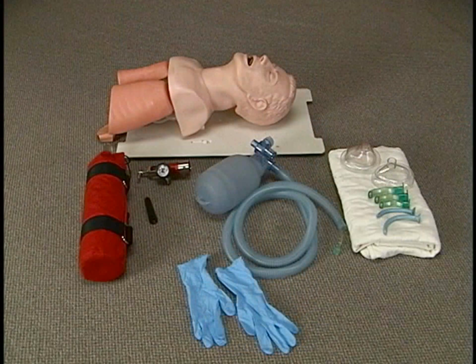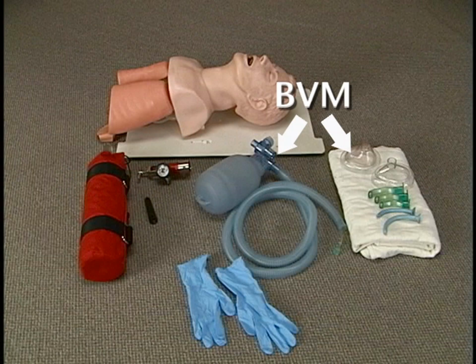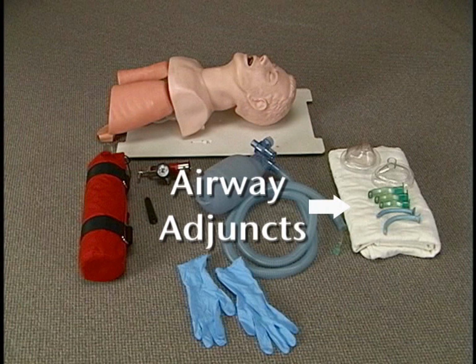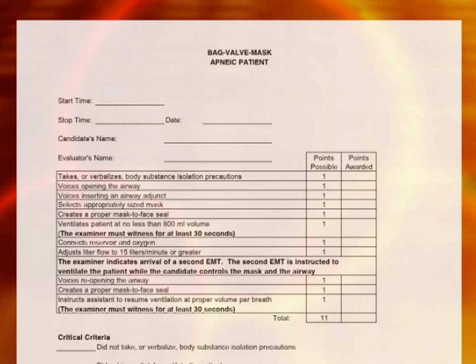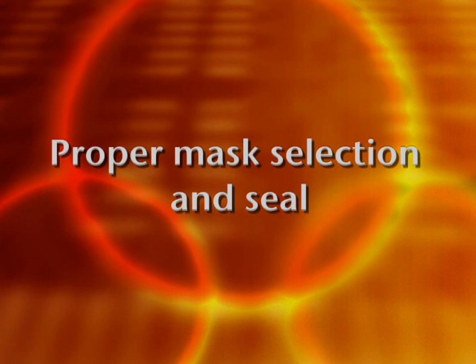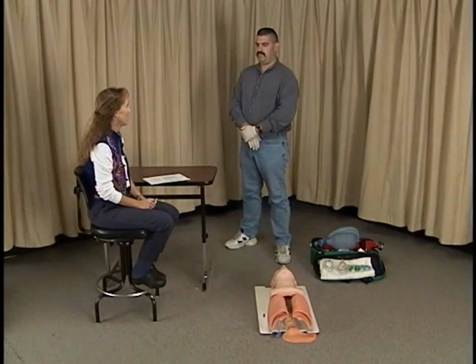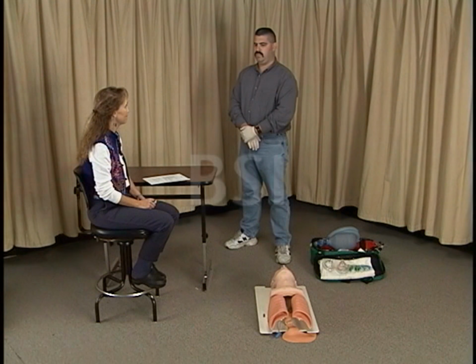Equipment and supplies for use at this station include an airway mannequin, bag valve device with masks of various size, supplemental oxygen, airway adjuncts, and medical exam gloves. The main sections of this station involve airway management, proper mask selection and seal, 1 rescuer BVM technique, and 2 rescuer BVM technique. You have an apneic patient that has no risk of C-spine injury. You've already examined your equipment, so go ahead and start when you're ready.